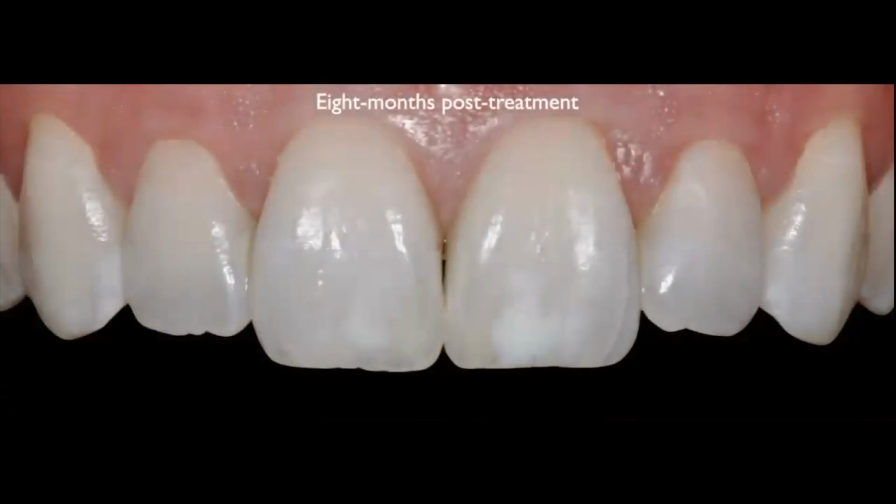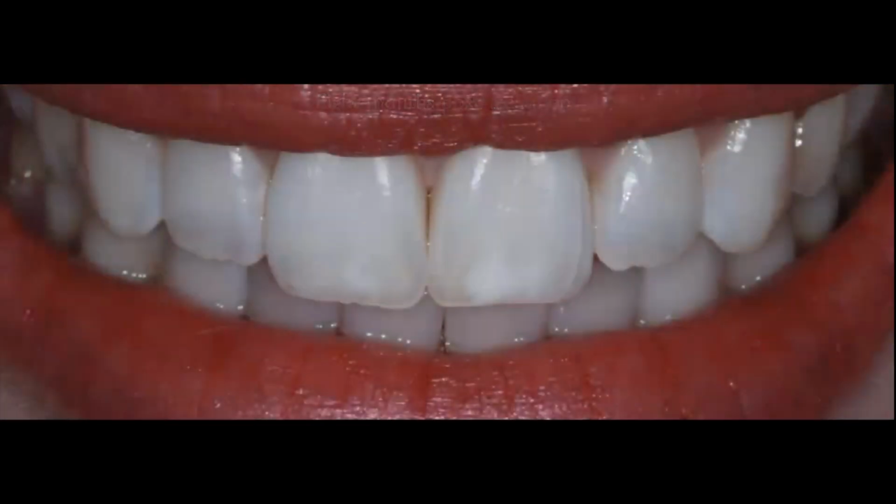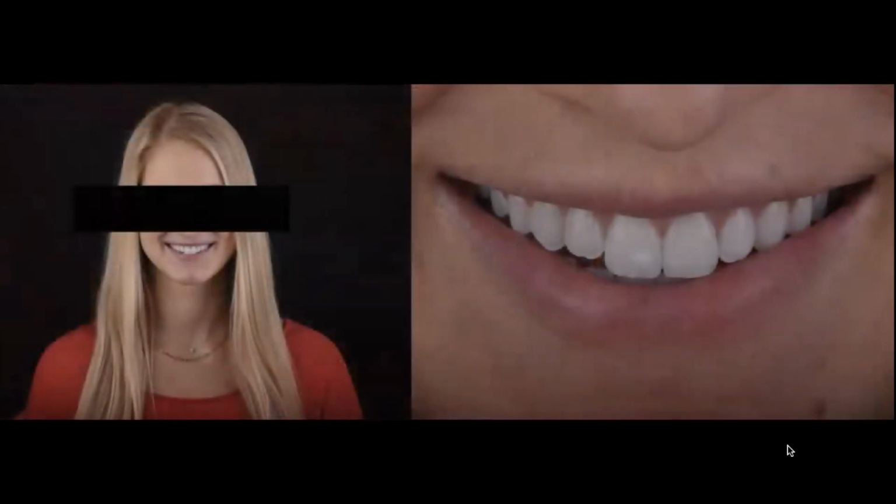This is the same patient 8 months after treatment. You can see a little bit of the white spots still remaining there, just as immediately after bleaching, but no more of the yellow spots. The enamel now looks a lot more natural. You can see that abrasion effect, how smooth and shiny that enamel is. And that's just the effect of using this product and going with these very stiff bristles and removing those small, very minor irregularities on the enamel.